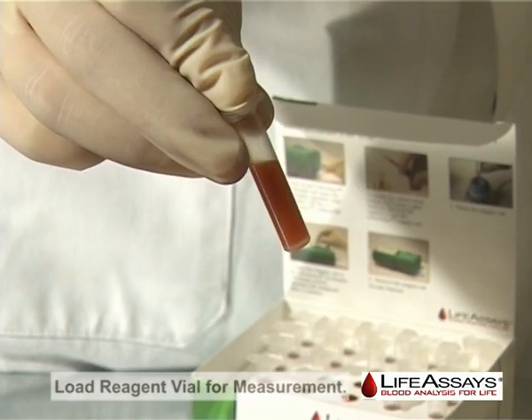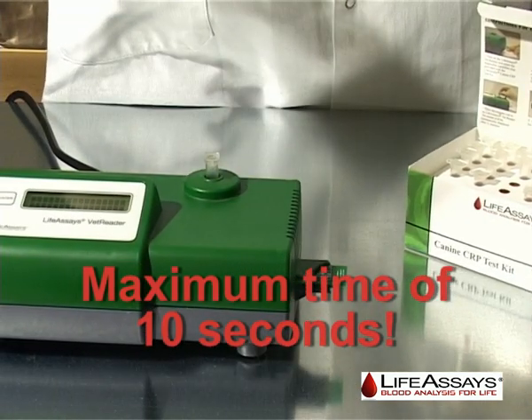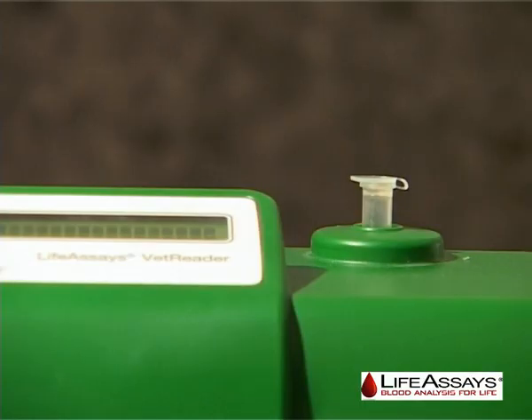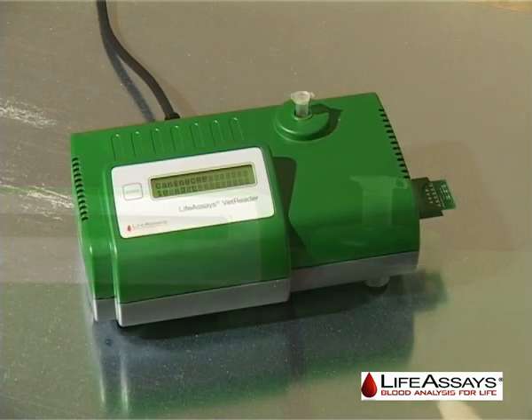This means the user has 10 seconds to confirm the pellet is completely suspended and then load the reagent vial back into the instrument. The user may now leave the instrument. The measurement will be performed and the result displayed after 11 minutes.